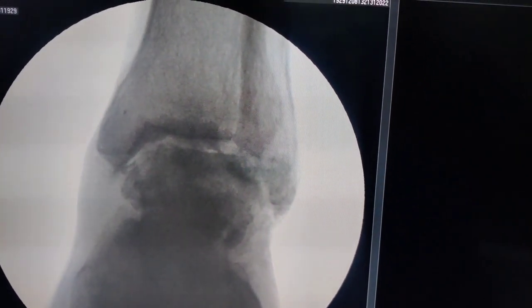So this is how you inject an ankle joint. This was a demonstration of how to do a steroid injection of the ankle joint. It is a rewarding procedure, useful both for diagnosing as well as alleviating pain in patients who have degenerative changes in the ankle joint.